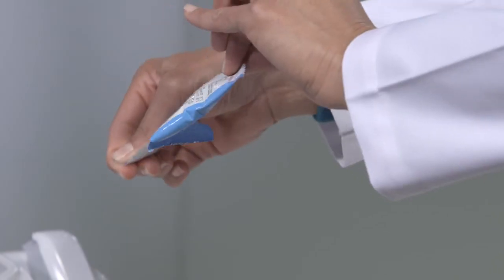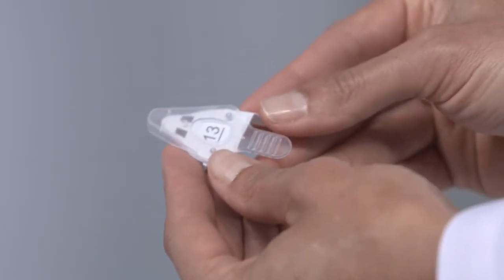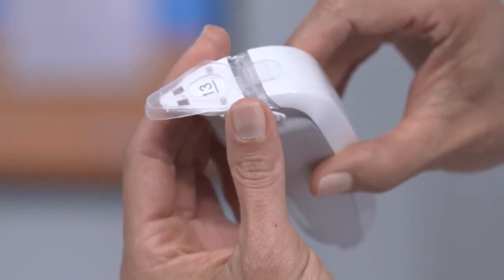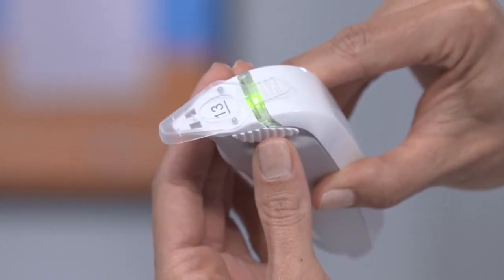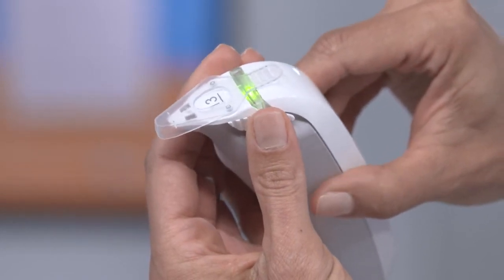Remove a test card from the pouch and note the numeric code on top of the card. Remove a pen from the TearLab. Hold the wings of the test card and insert the test card onto the pen. Ensure that the wings of the test card are snapped tight to the pen. A green light will illuminate and a beep will sound, indicating that the test is ready to be performed.